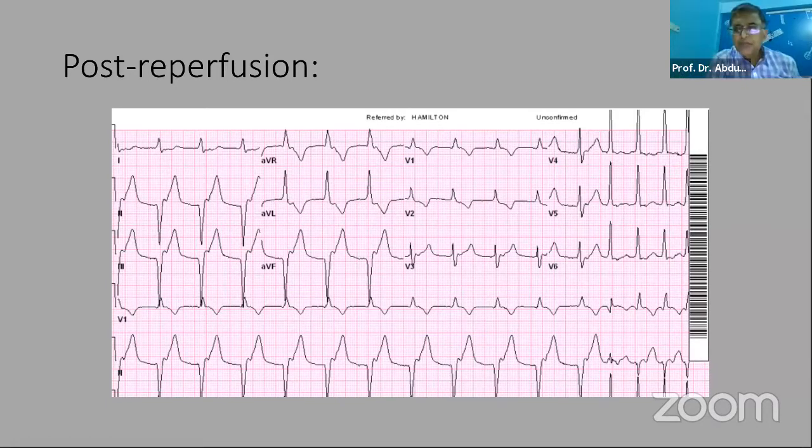So you said ventricular tachycardia, right? Yes, sir. And why did you say ventricular? I mean, your answer is correct, actually. With a little bit of modification, it is the correct answer. Why did you say ventricular tachycardia? Because there is no P wave and there is concordance in the chest leads.